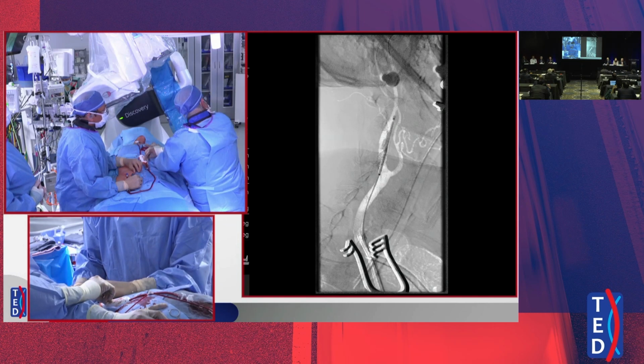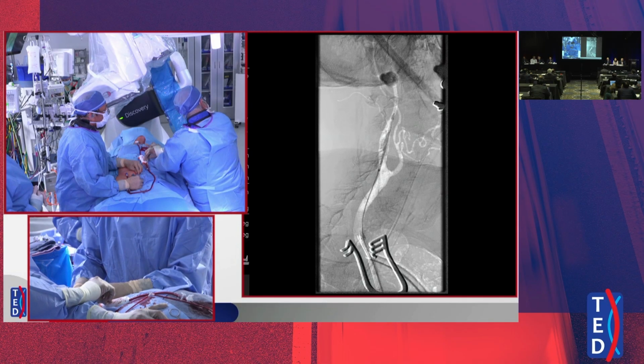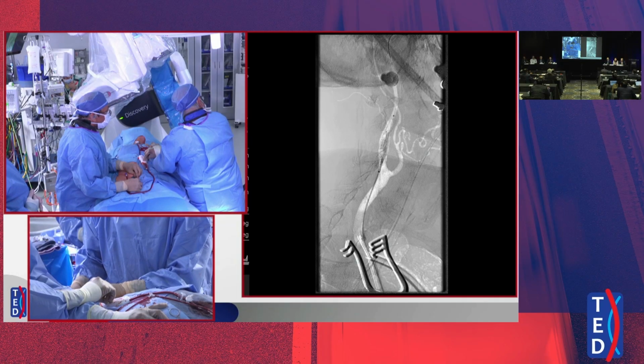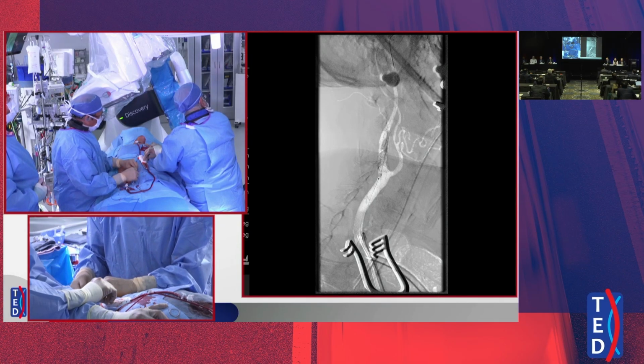I would come back a little bit. We'll see how it looks. I don't want to go any higher than that, a little more toward the common, yeah. That probably can get away with. I would extend to the common and land a little short on the internal carotid. I'm going for perfection. Maybe not. There you go. Okay. Let's see.